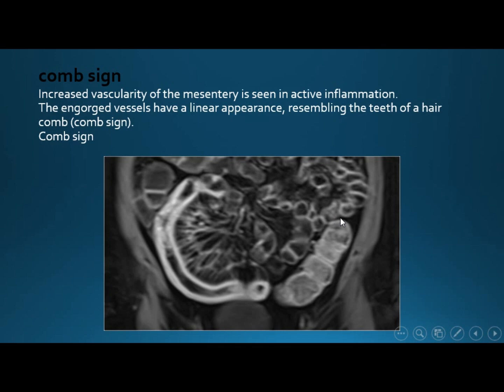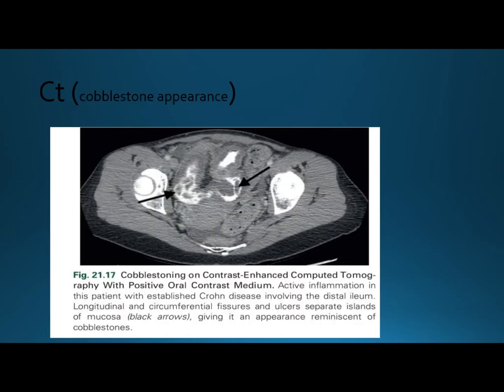This is the comb sign. The comb sign is an engorgement of blood vessels — increased vascularity of the mesentery — seen in acute inflammation. The blood vessels have an appearance like the teeth of a comb. This is also cobblestone appearance on CT — this is contrast CT axial section. We can see this white line is the ulcer.